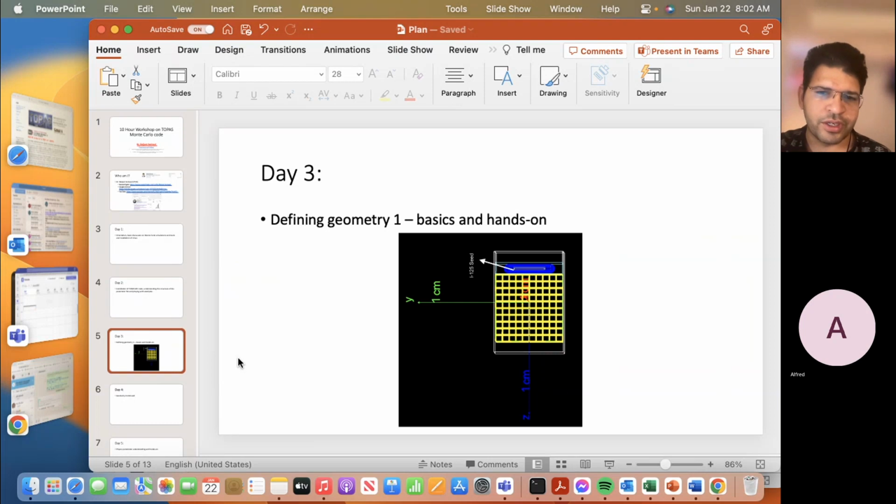I decided to start this course with this simple geometry. There is an iodine 125 seed, above it is the lead shield to shield the radiation that goes on the other side of the seed, and in the yellow is the mesh, and that is the voxelized water phantom of 0.3 millimeter voxel side length, and we will be depositing the dose emitted from the iodine 125 source in this water phantom, and we will be analyzing it.